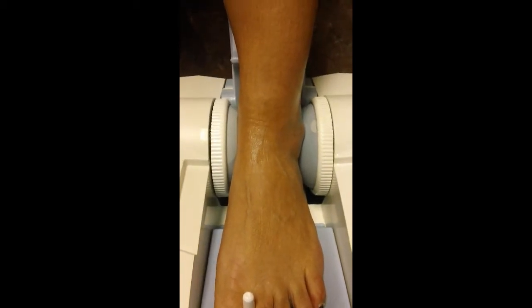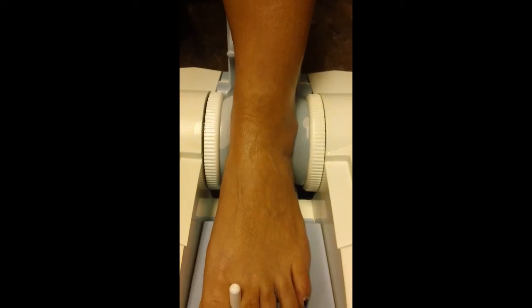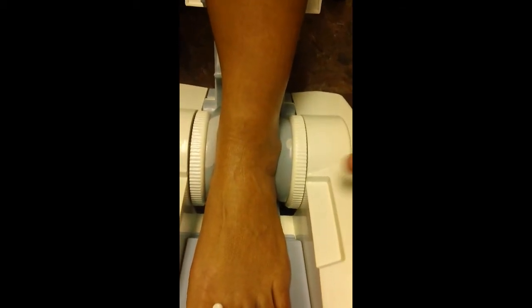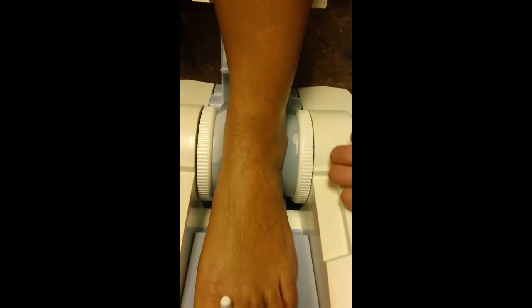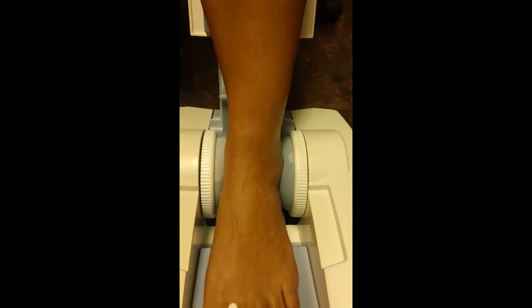This actual scan process only takes approximately 15 seconds. During this process, it's sending sound through the heel — it's looking for speed and attenuation. The nice thing about using these membranes is it gives you a much larger coupling area with the heel, so that when you're scanning the calcaneus, you'll be able to get a larger area of bone for sample to provide your results. Once the scan is done, the membranes will simply pull back and Suzette will be able to remove her foot from the system, and the alcohol on her ankle will simply dry up.